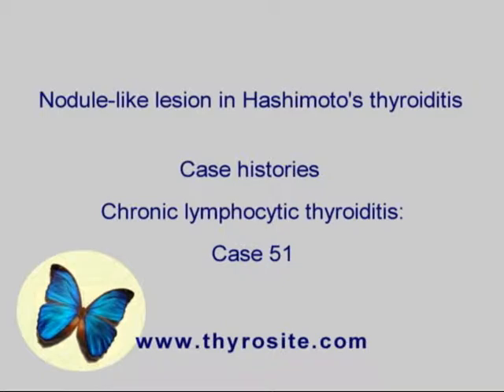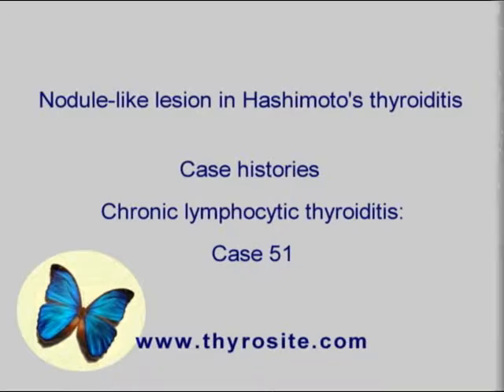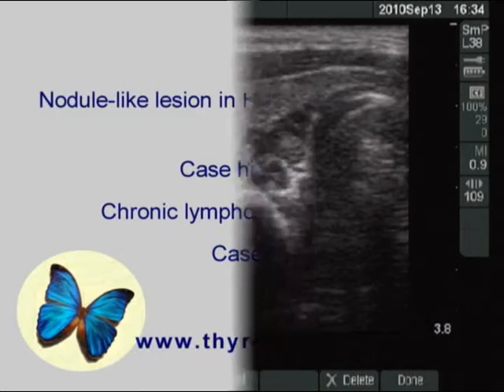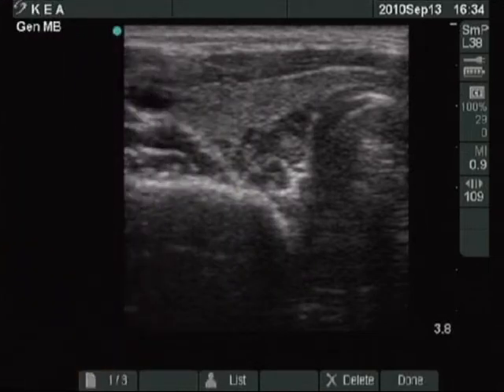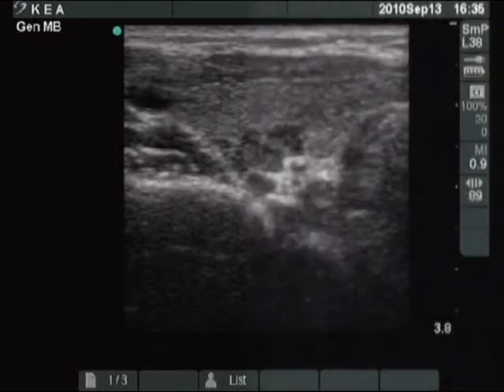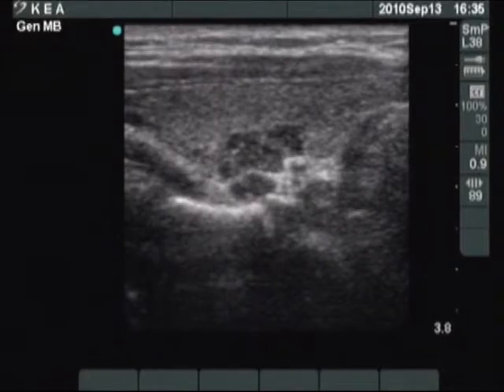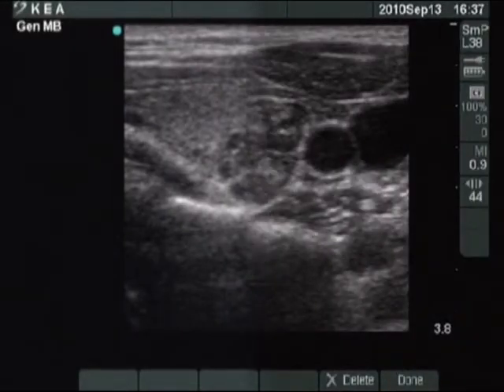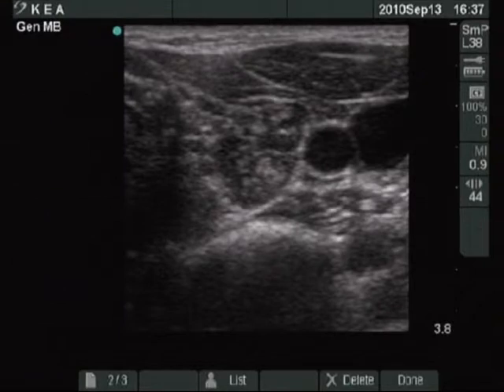Previous FNAC resulted in oxyphilic variant of papillary cancer in this woman who suffers from hypothyroidism. There is a hypoechoic area in the dorsal part of the isoechoic normal lobe. The lesion is divided into smaller areas by fibrotic tissue.